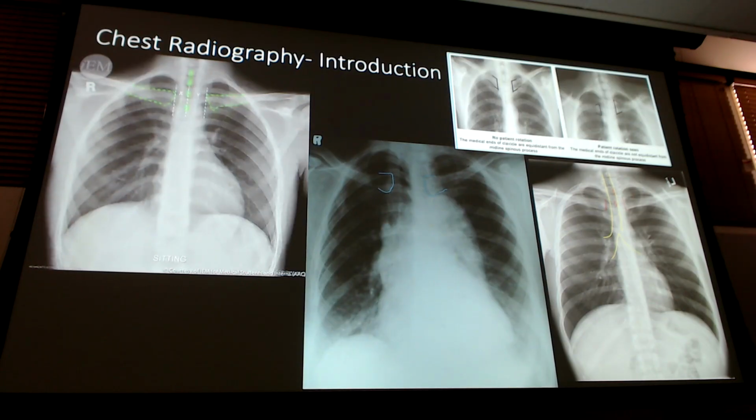Now my next 2 below pictures are the abnormalities, right? Can't really make out my spinous processes, but look at where my clavicle end is, and look at where the other one is. I have one with this huge gap. Is that dislocated? I don't know, maybe. That's kind of tough to dislocate your SC joint, but it can happen. But I'm going to suspect no, because the other clavicle is also more medially and into the spine than it should be. That clavicle is not being shoved into that area, right? They're not both dislocated. Now, if I had this gap and a normal clavicle on the other side, then maybe.